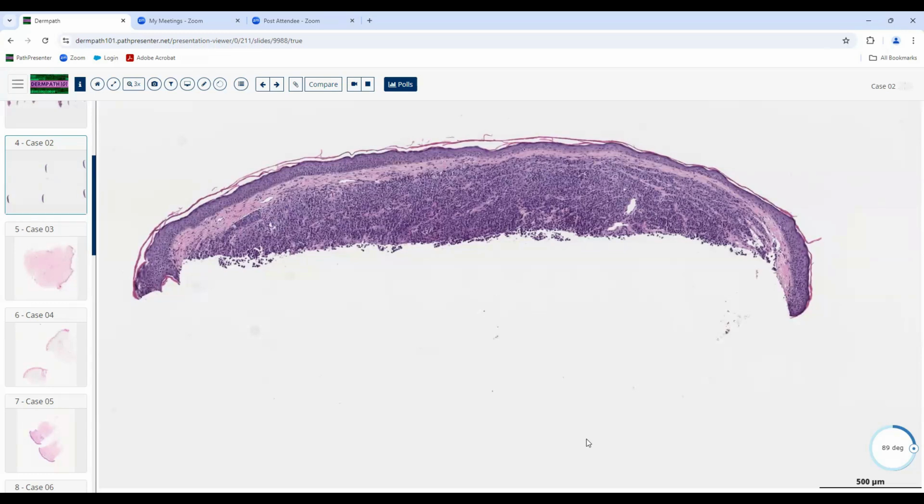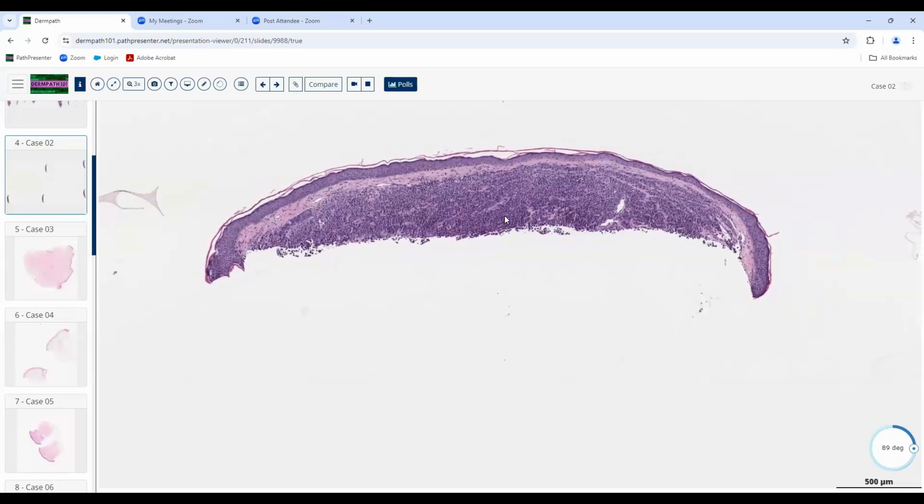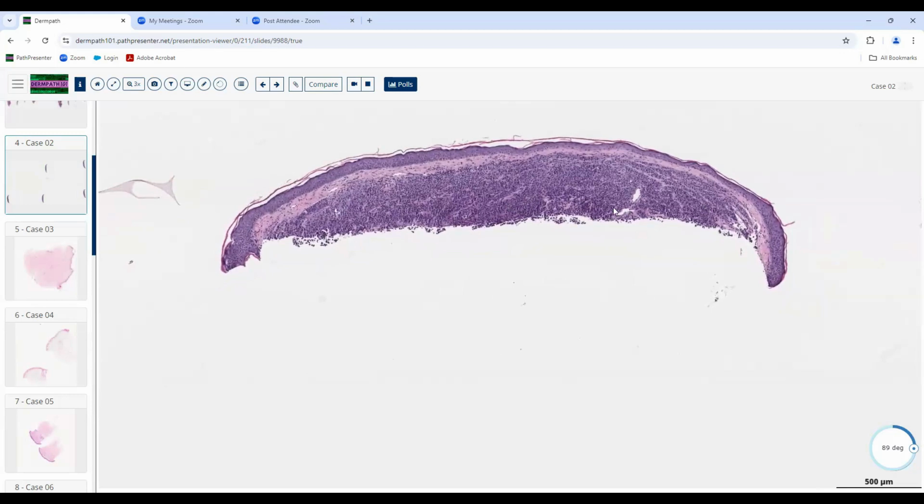So when you get metastatic lesions, it breaks the rule of architectural symmetry, size, circumscription, all those kind of things. So just remember that even though those are cardinal rules of benignity at low magnification, metastatic lesions can break that rule. So this was an example of a metastatic melanoma.